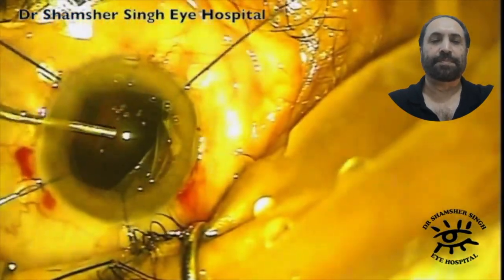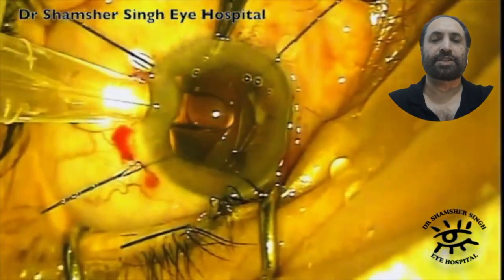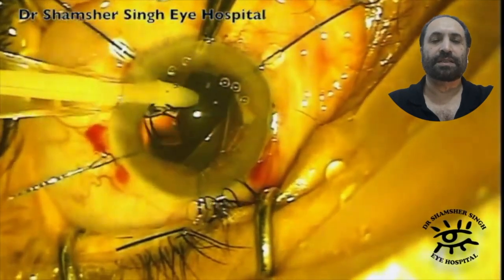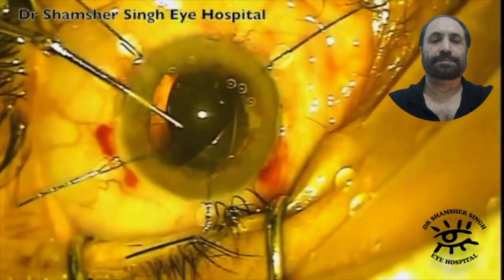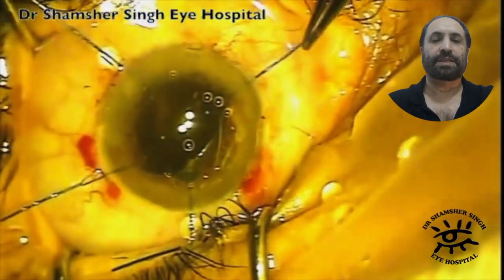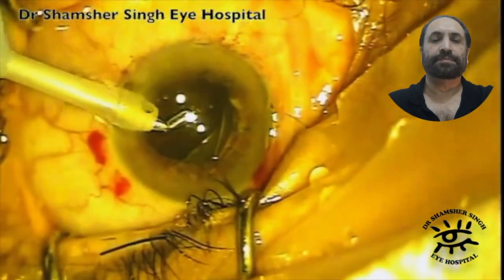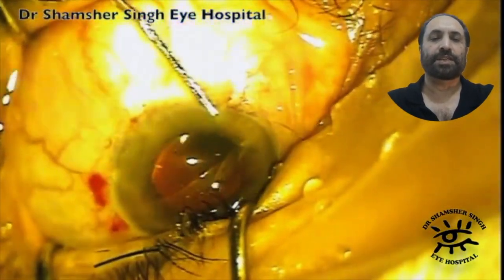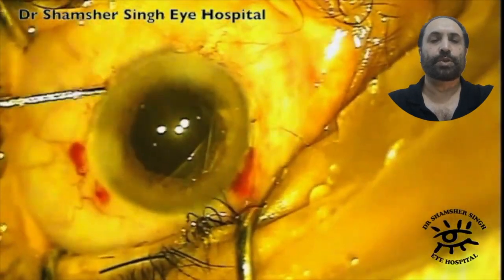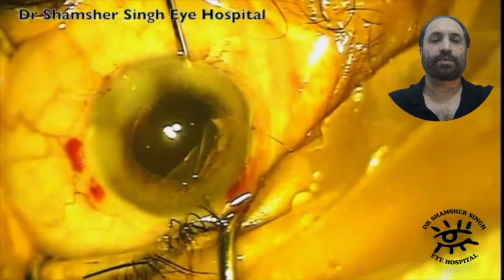The capsule is very clear and I inject — in this case I think one of the Zeiss models of IOL. Once the IOL goes in, you remove the iris hooks, do the irrigation aspiration, and then hydrate the cornea to make it watertight.